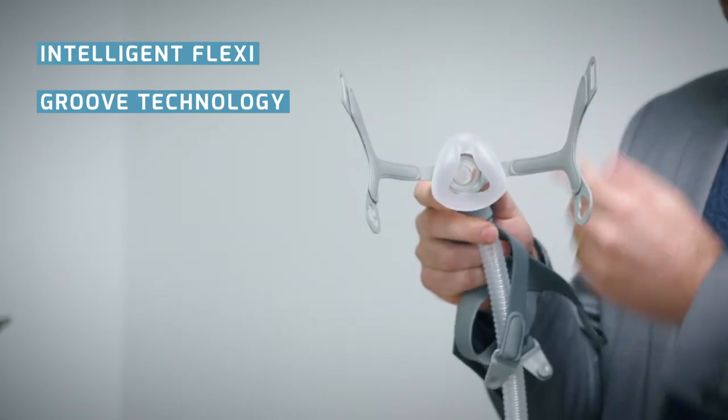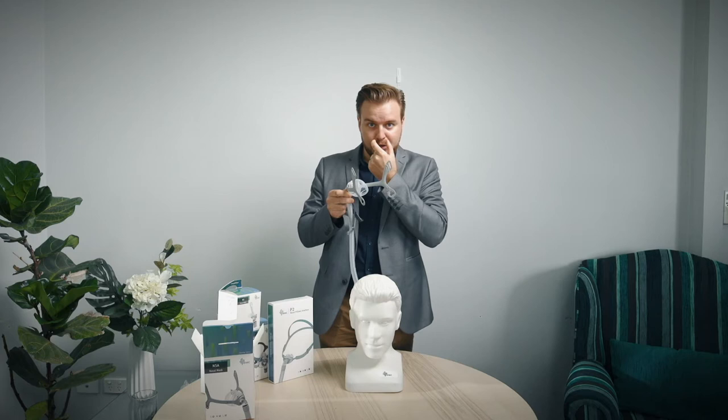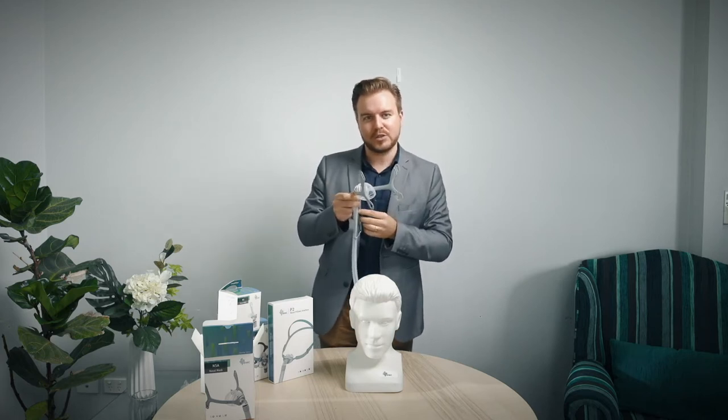When considering this mask and trying it out, to find the right cushion size ensure that all parts of the silicone are touching your face and that it isn't crushing your nose together or pushing against your brow — that's how you know you've got the right size cushion.